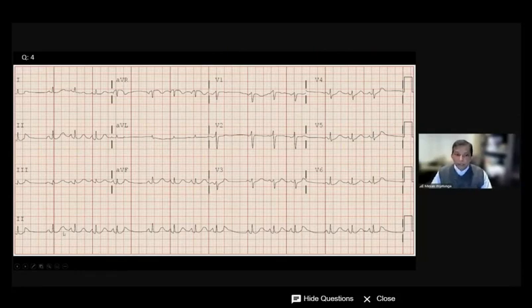Look into each beat. Zoom them. I cannot emphasize enough how much this is necessary. So you see that the easiest way I prove it, I look at the preceding T wave. It looks sharper here. See that the fourth one here? And then I see a gap. And then I measure this. Look at this one. P to P. This is beating about this P, that P. Closer to 100 beats per minute.